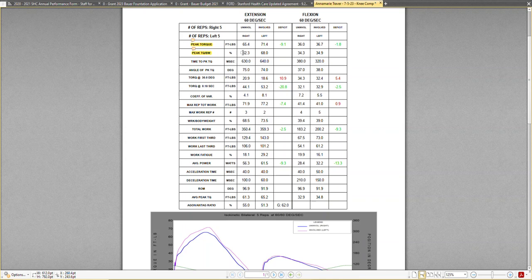It's a really robust metric to predict someone's return to activity, but it's also important for longevity. When we look at someone's potential for vitality later in life, their peak torque to body weight is critical. You could even use peak torque relative to fat-free mass, but you would need a DEXA in order to get that.